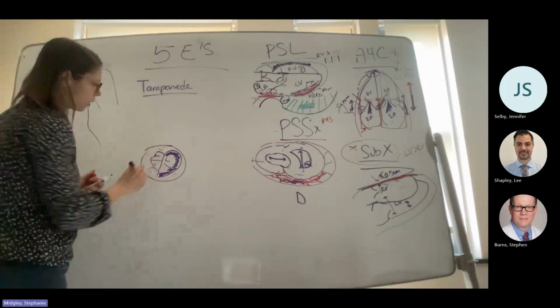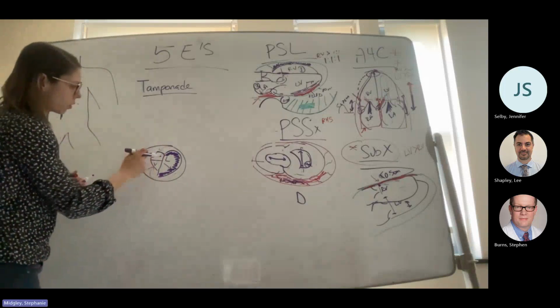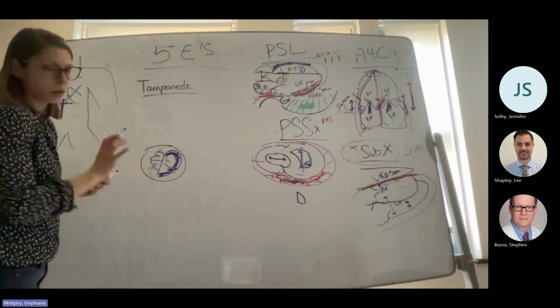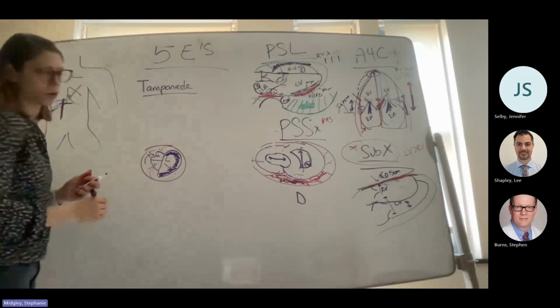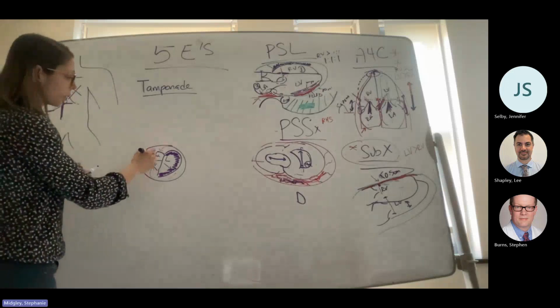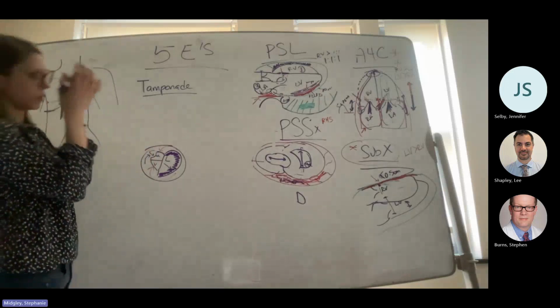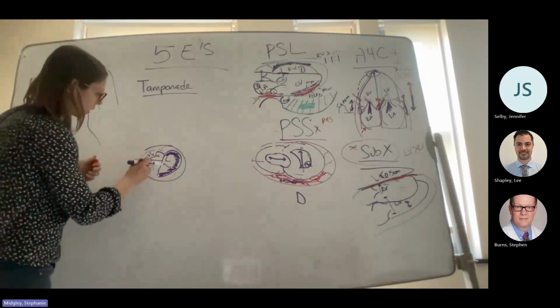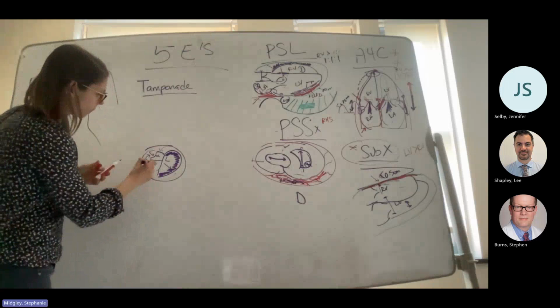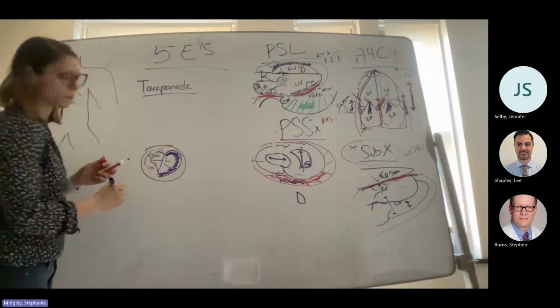What's going to happen is my atria is going to get squashed inward when it tries to fill, because that fluid is going to exert its pressure on it. At some point, the atria is like, oh, stop picking on me, I've got nothing left to give you. So that fluid says, all right, fine, I'm going to go to the next weakest guy, which is the right ventricle.